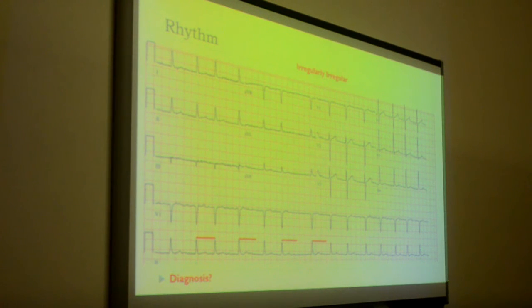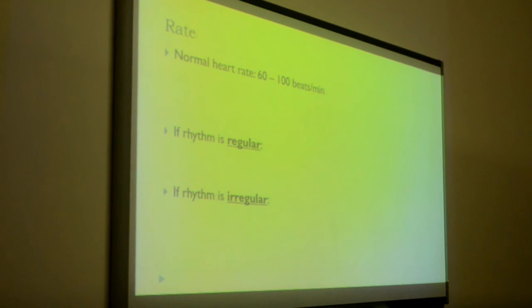We had a physician in our cardio rotation who had a compass with 2 needles. He'd take the ECG and go from the beginning to the end, making sure the distance between all of them was the same. So it's important to analyze it from beginning to end. But when you clearly have something like this, you know it's irregularly irregular. If it's irregular, then I know that it's atrial? No, it's most likely, but there are other causes. But as a medical student, what we'll most likely be asked about is atrial fibrillation.